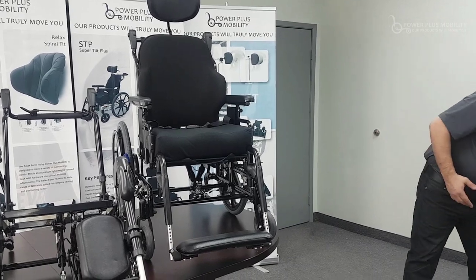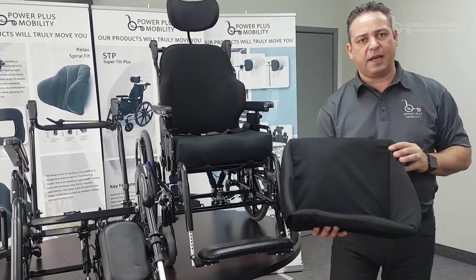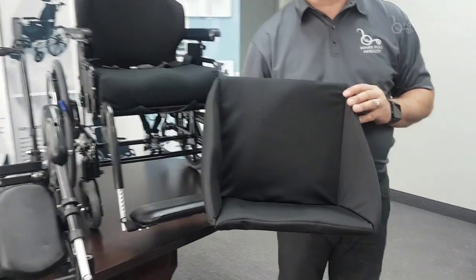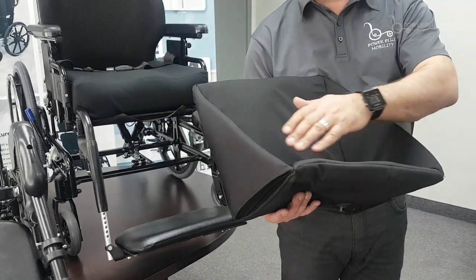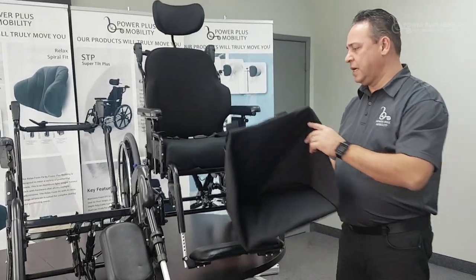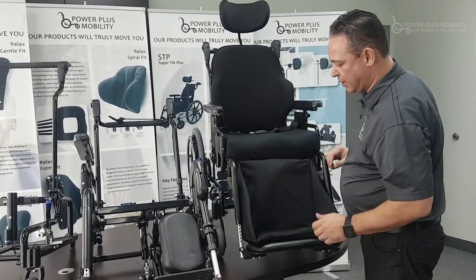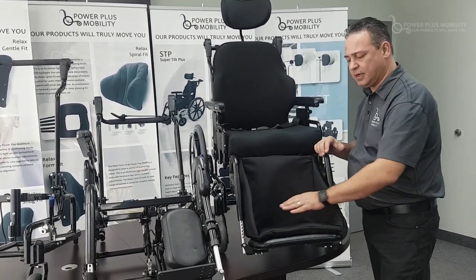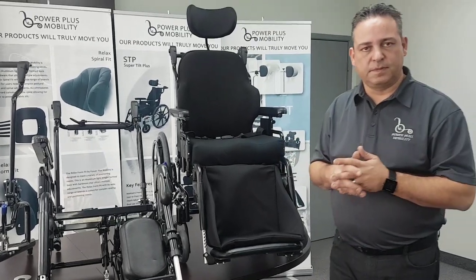One last option is to mount a padded footboard. This comes in two options: a padded footboard or a solid composite footboard with padding within. It mounts in through here, keeps your feet nice and snug, and keeps your feet within the box. Thank you very much.